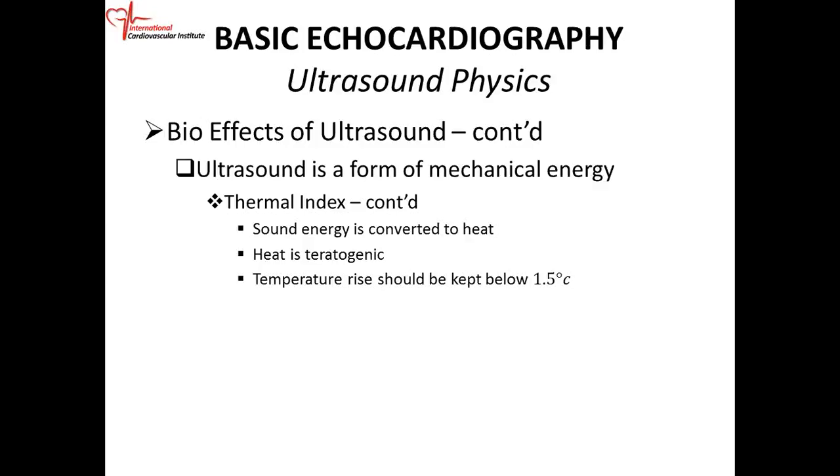So basically what we're saying is that the sound energy is converted to heat. And of course heat is teratogenic, so it can cause injury in the developing fetus. So your mechanical index is the cavitation potential of ultrasound, and heat is mainly a concern for the fetus, rapidly growing tissues. So if it produces heat, it can destroy or damage the developing fetus.